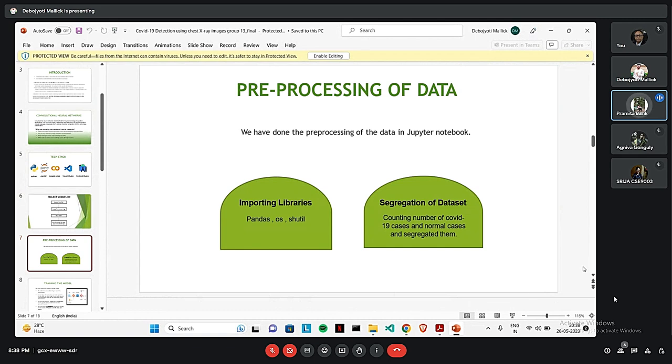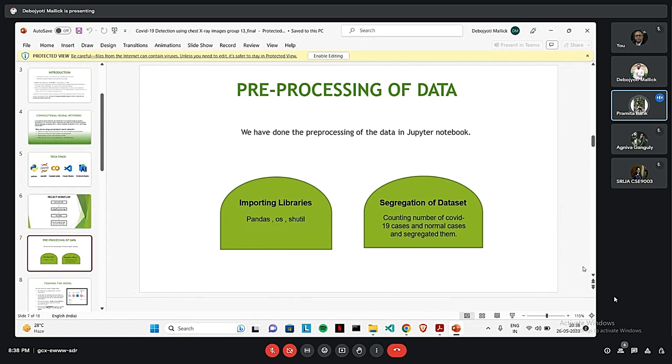Now coming to the pre-processing of data. We have used Python as the language and Jupyter platform to pre-process the data. At first, we will import the required libraries. Then we will upload the dataset from where at first we will select the COVID-19 images, then the normal images into separate folders. Then we will upload them in Dropbox and use the images for the training of the web app.